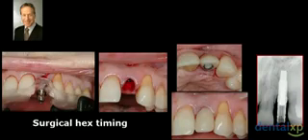Again, repeating what Scott mentioned before about the absence of trauma to the soft tissue. Although you saw Scott use a forceps, I just about used my fingers. That's really atraumatic. And this is the immediate postoperative view of the temporary cylinder in place. And you may ask, well, gee, I don't see the restoration. Well, that's because a naked temporary cylinder was fitted to the implant to make sure that we could seat it.